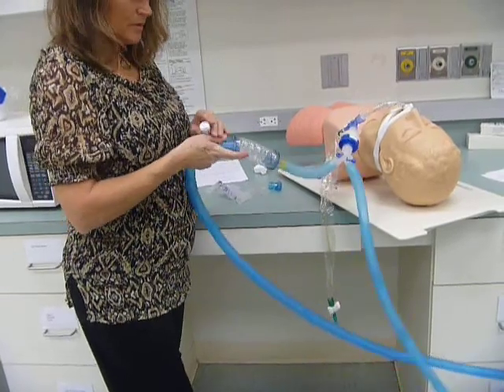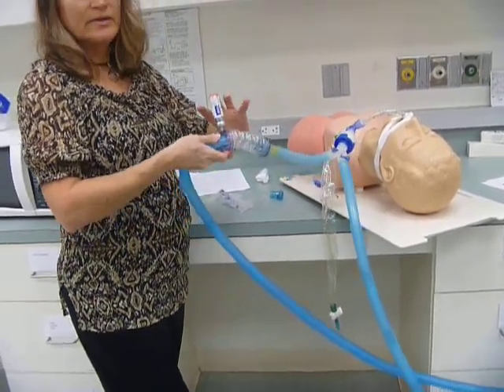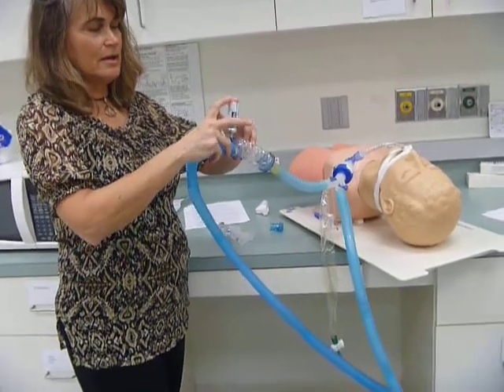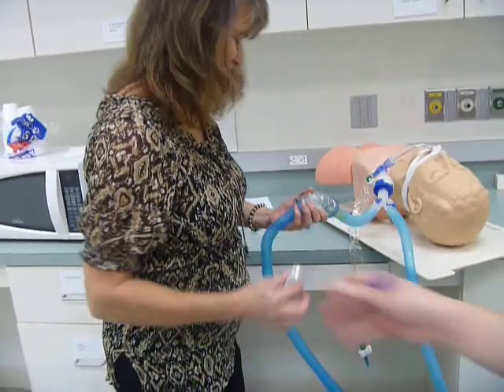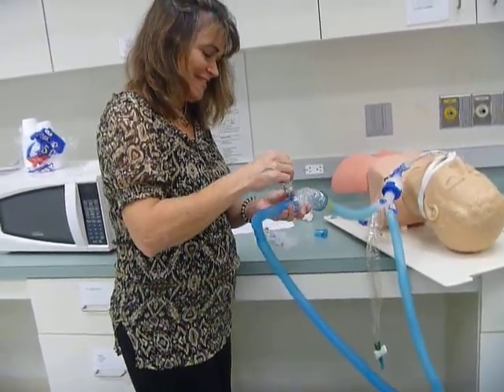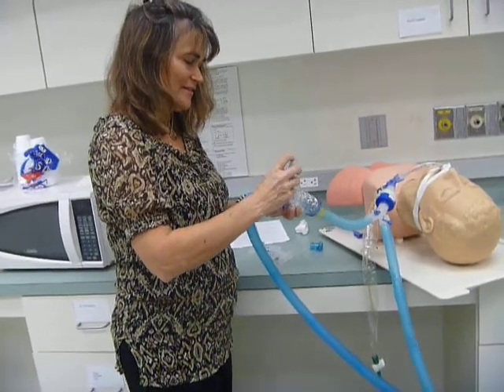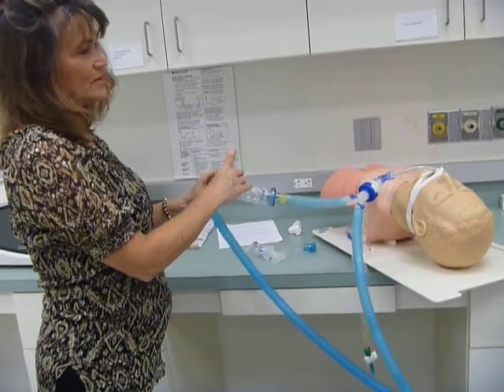And I wait for a breath to begin. I hear inspiration. You can hear the air going in. It's still not on very tight. You have to hold it the whole time. It's clumsy.